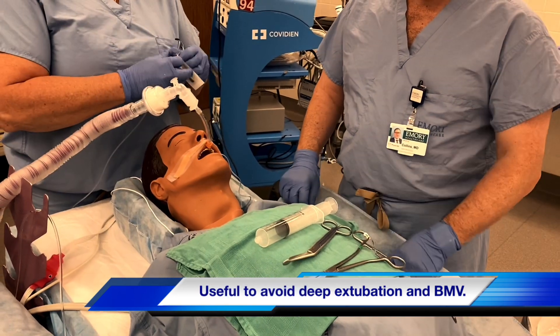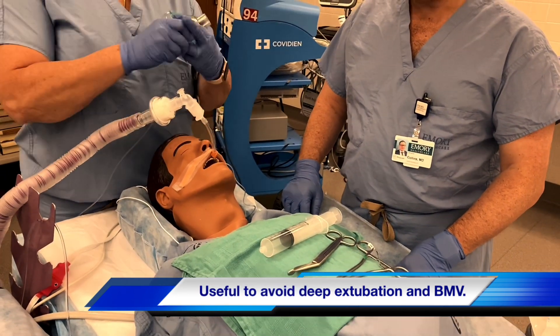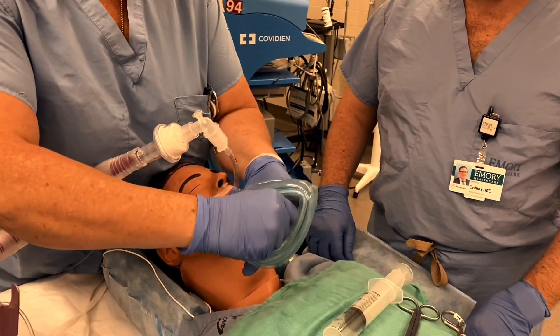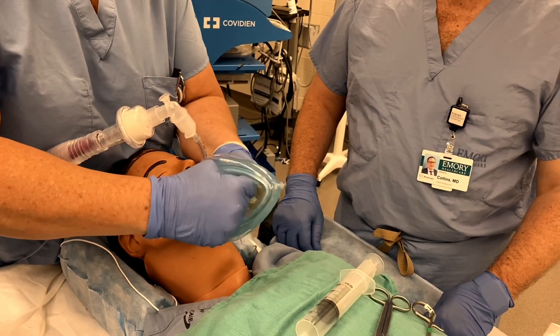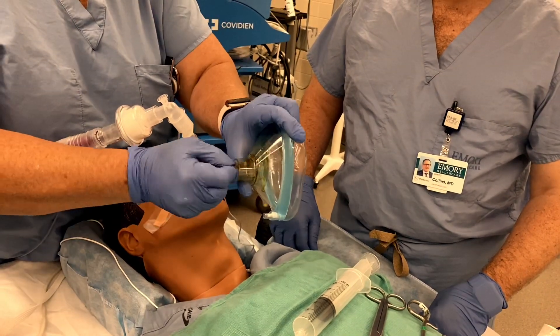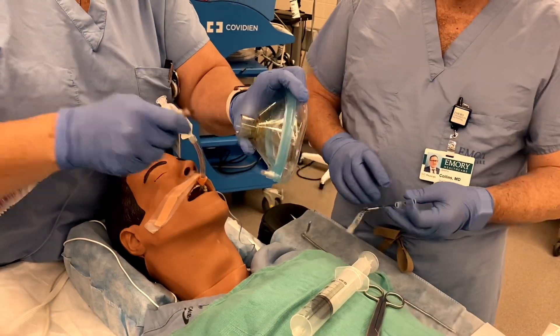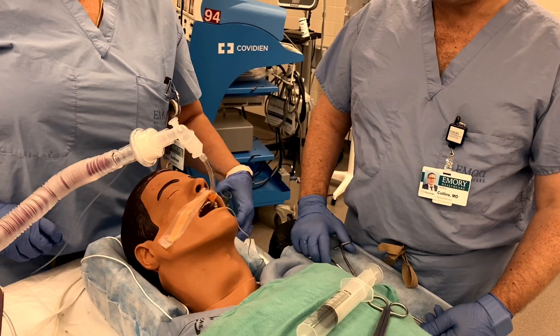As you get into a point where extubation is impending, prior to reversing your patient, you want to prepare your mask by putting some benzoin or mastosol around the inner lip, and especially around the connector. This is because patient secretions could potentially make the cuff slick, so you want to have a sticky surface.